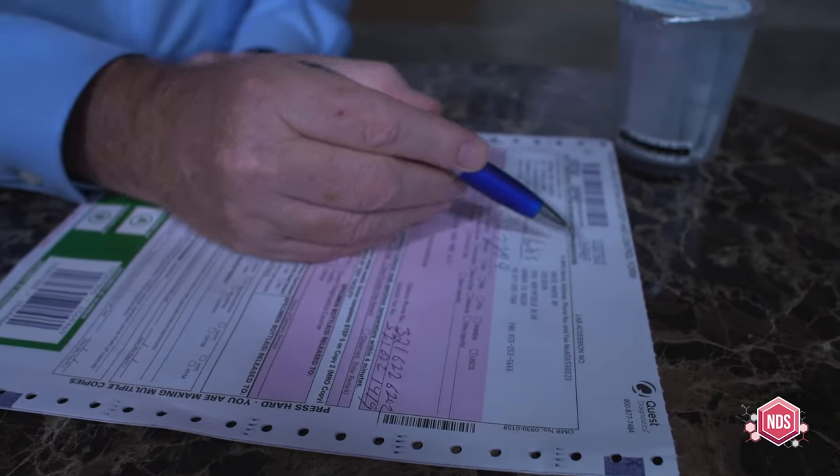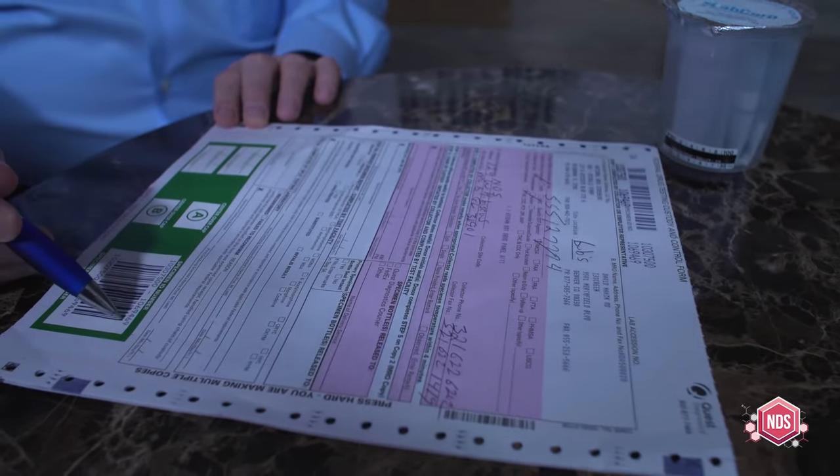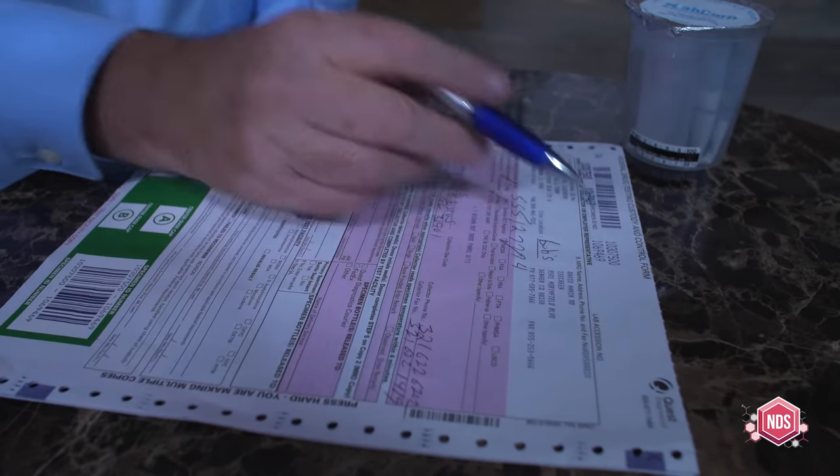Do you have your ID with you — driver's license? I do. And that's Tom Fulmer. That's correct. Tom, I want to point out to you on this form there is a unique specimen ID number. It starts with 106 right there. That same number is on the specimen security seals that will go on your urine vials. We'll have two vials — an A bottle and a B bottle. I just want you to make sure that those numbers match up. Looks like they do.